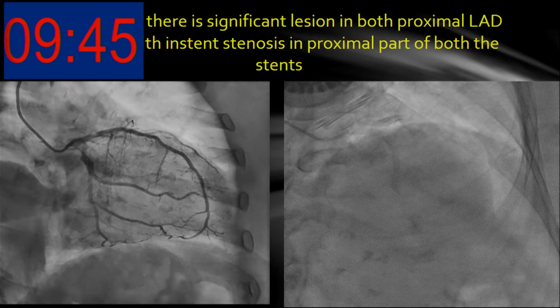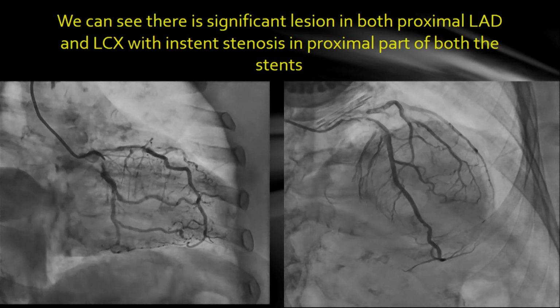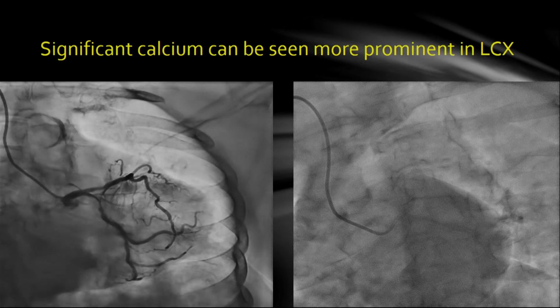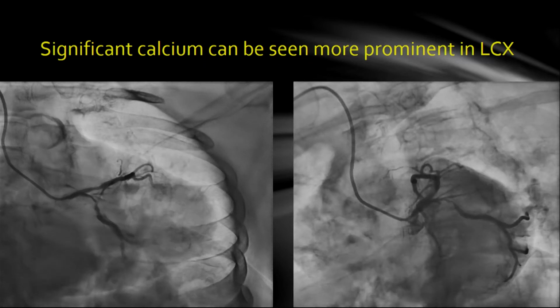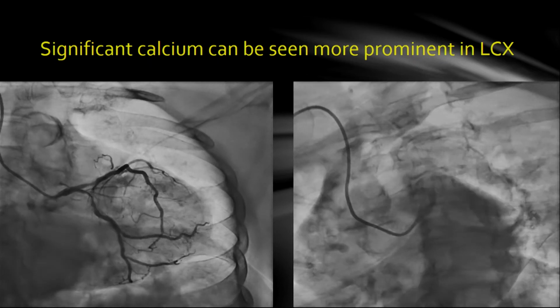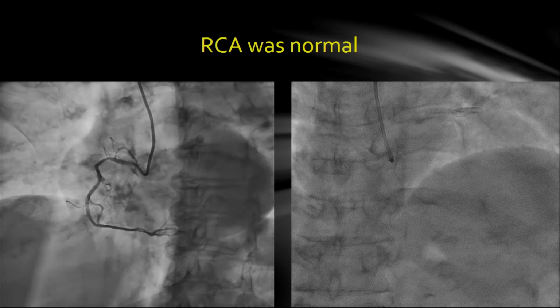And you can see there is a significant lesion in the proximal LAD and also the circumflex ostium, the circumflex proximal lesion, and also ISR. Here in this view, though the LAD ostium does not look significantly stenosed, in IVUS it showed there is calcium of almost 270 degrees, and the ostium diameter was 4.6 or 4.5 like that. RCA was normal.